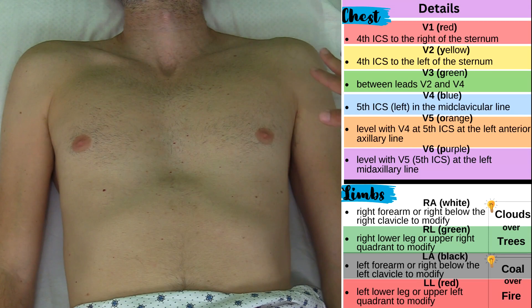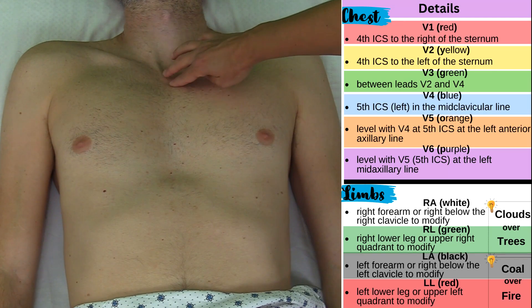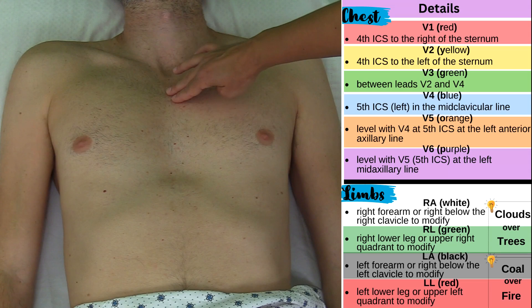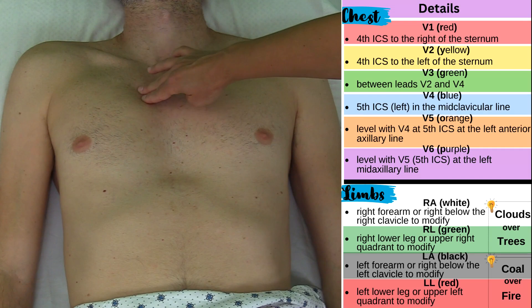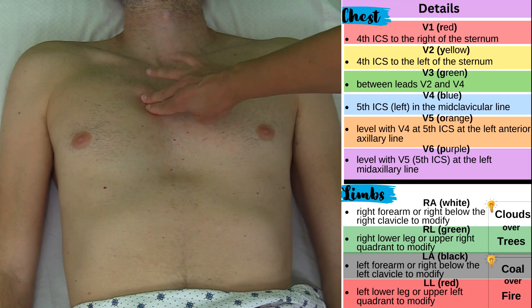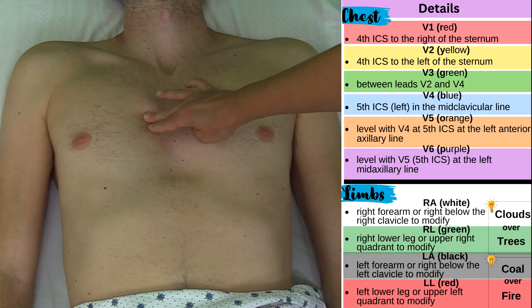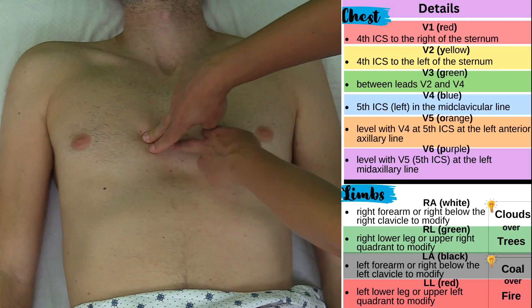Now I'm going to place the precordial, or chest, electrodes. To do this I need to use landmarks, because my goal is to get to the fourth intercostal space first — that's where V1 and V2 are going to go. So I'm going to find the suprasternal notch right here; it's like a notched-out area in the bone. Travel down a little bit and you'll come across the hump known as the angle of Lewis — it's like a ridge. Then from the angle of Lewis I go to the right and feel something hard — that's the second rib. Slide my hand down into a space where I don't feel anything hard: that's the second intercostal space. Slide a little more, go over a bone, feel the third intercostal space, and just a little bit more — I feel the fourth intercostal space.